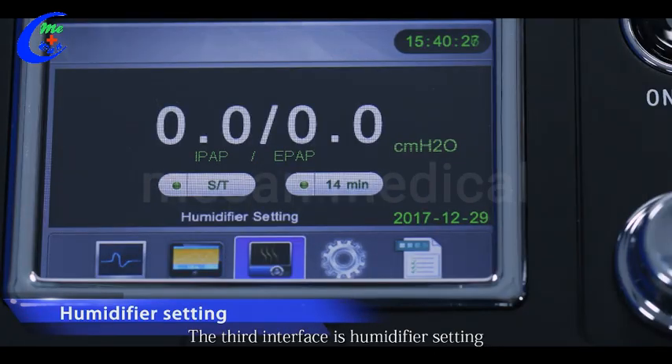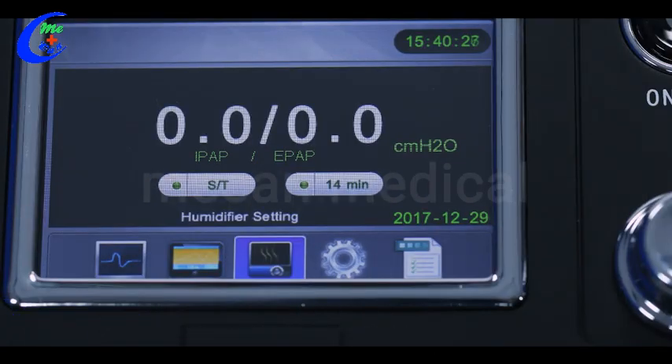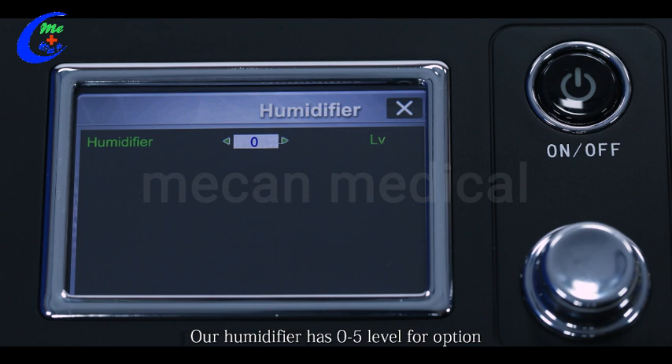The third interface is the humidifier setting. Our humidifier has 0 to 5 levels: the higher the level, the higher the temperature. Level 0 is off; Level 1 is 45°C; Level 2 is 50°C; Level 3 is 55°C; Level 4 is 60°C; Level 5 is 65°C.